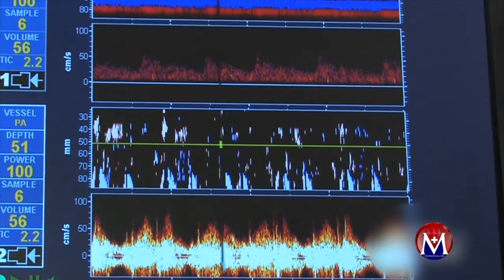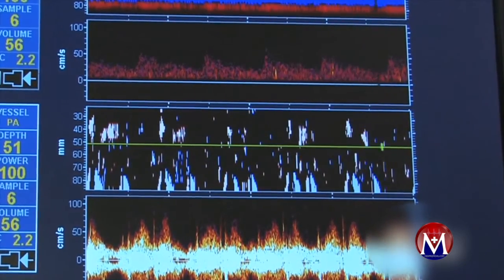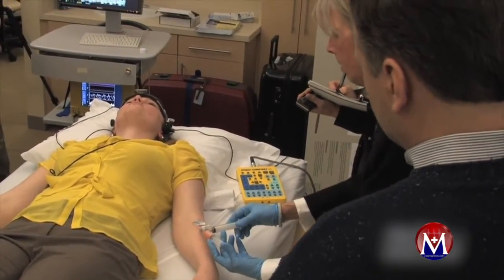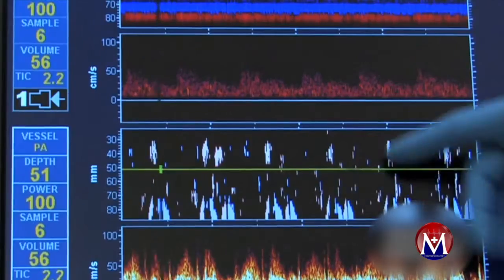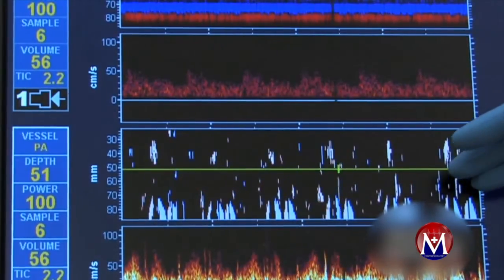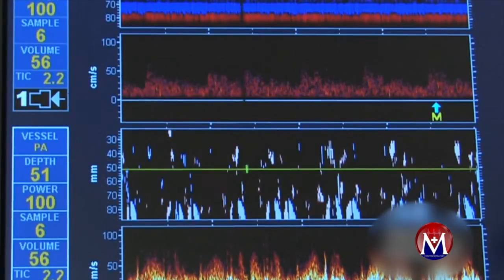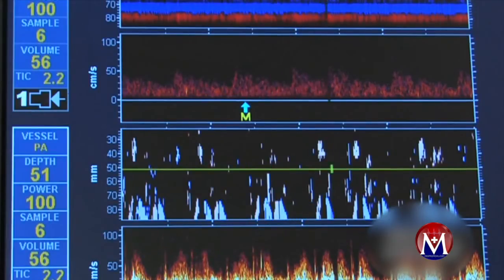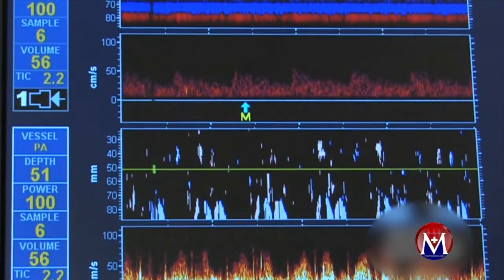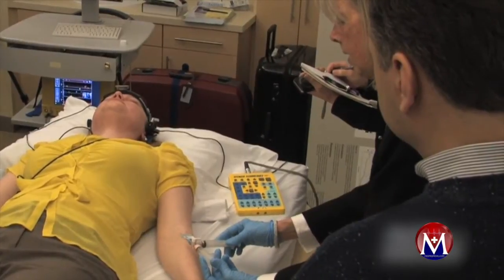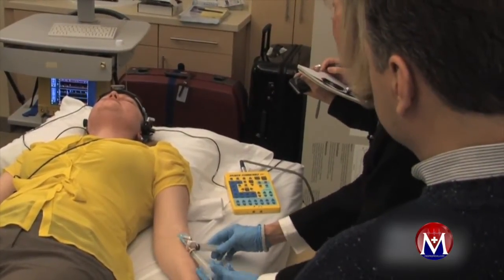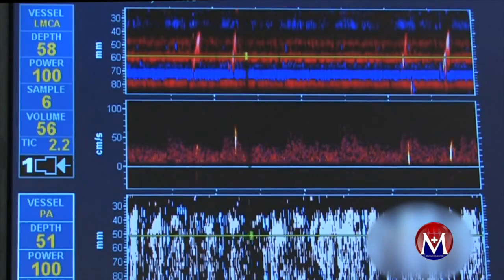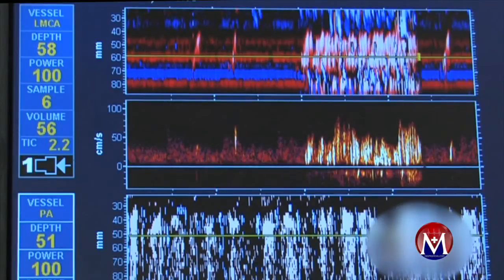The blood actually helps make the bubbles smaller, which means you'd have more bubbles. What we're looking for is first an intense signal in the pulmonary artery, which confirms the bubbles are reaching the heart. We'll count how many beats it takes to get there, and that will guide us during the strain portion of the test. When she injects, I'll press save to mark the injection time on the machine. That was about seven beats over the air bubble, and then one or two beats before they arrive in the head.